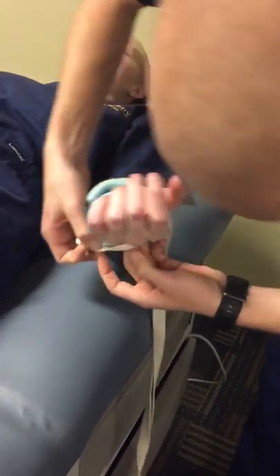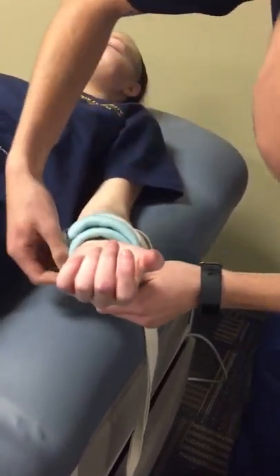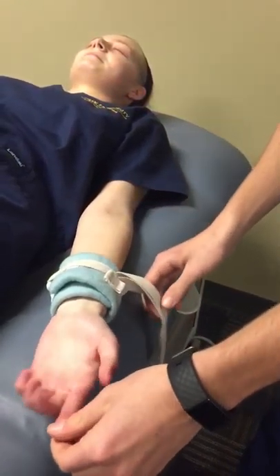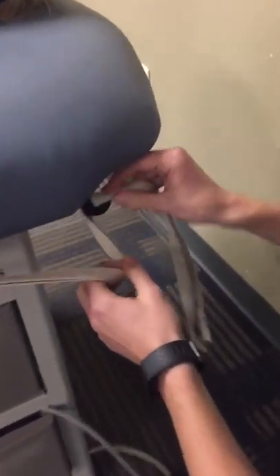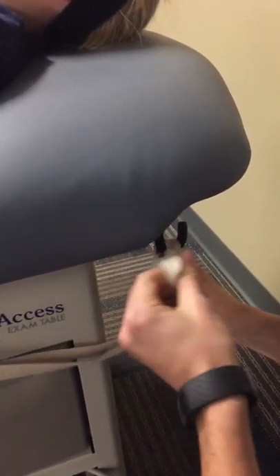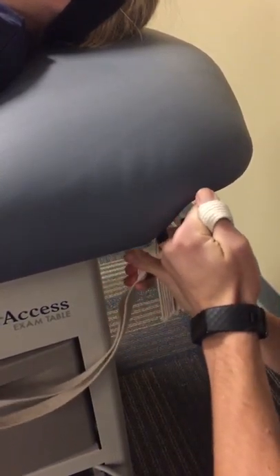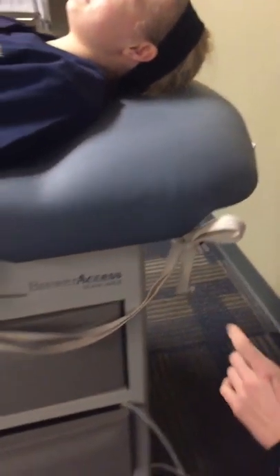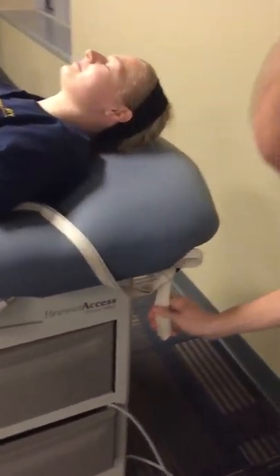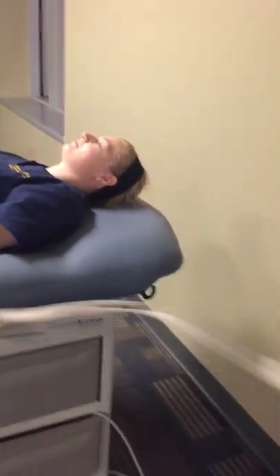Then you want to tighten any adjustments that can be tightened — here you would tighten that one — and you would look for color change and the capillary refill. You would then tie it to the bed frame. The slip knot would ensure that the patient cannot escape it, but if needed, you can easily pull and then they're free.